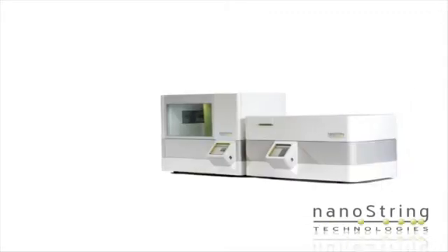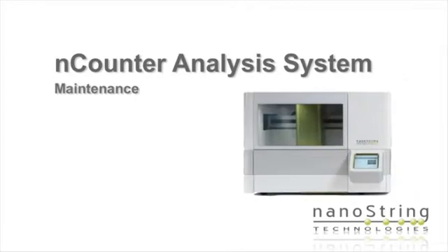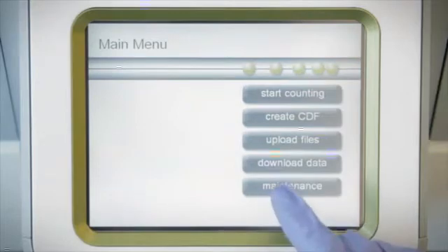In this video, we show you some of the maintenance options which are available for your nCounter system. We will first show you procedures which are common for both pieces of equipment. Then we will show you procedures specific for the prep station, followed by procedures specific for the digital analyzer. On both machines, the maintenance menu is accessible from the main menu by simply pushing the maintenance button.